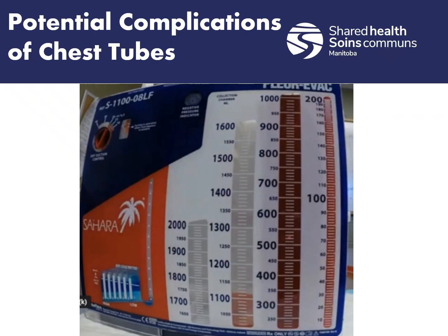So if you start seeing blood flowing out of the tube as fast as this, it might be a call to vectors to return back to the facility or go to HSC if that's an option for you, because that means there's some kind of possible internal damage or some kind of rupture inside the chest, and we can't deal with that. So that's closest open, or hopefully an appropriate facility if you have a conversation with vectors.